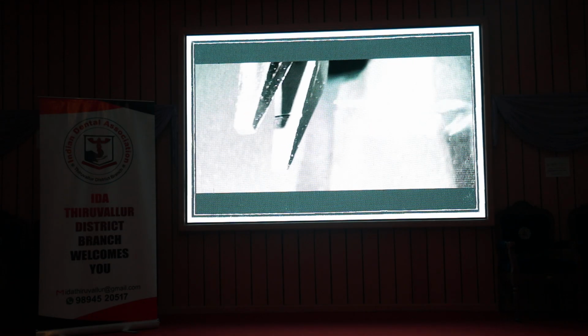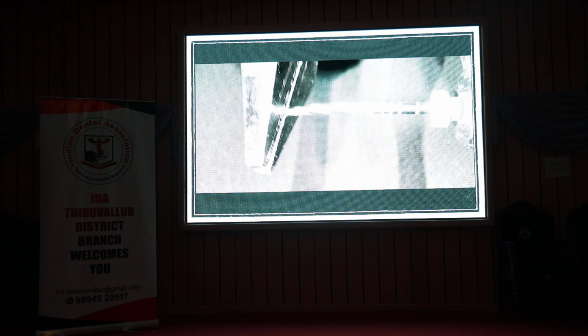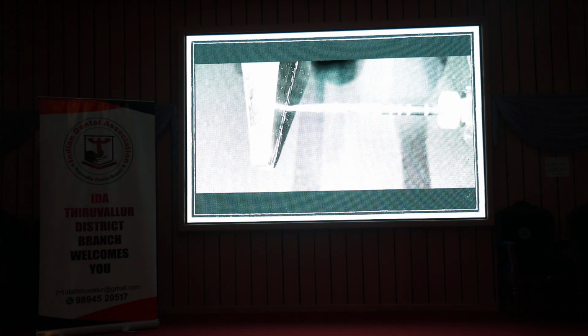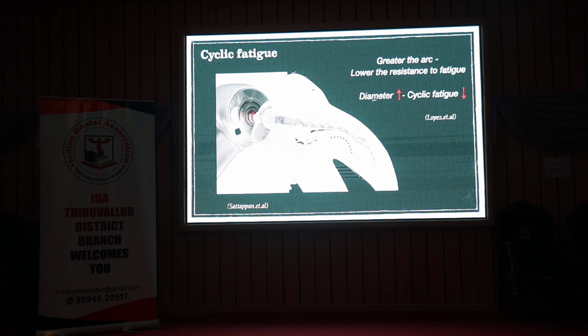You can see I'll just ask them to hold the tip, whereas the other part, the motor is trying to rotate the file, and then after some time, of course, it just resists, and then after some time it will definitely break.